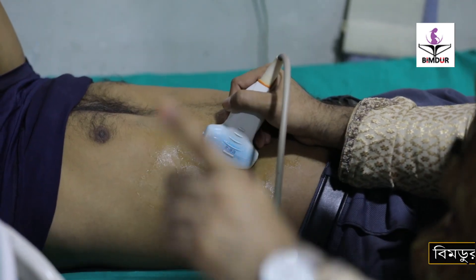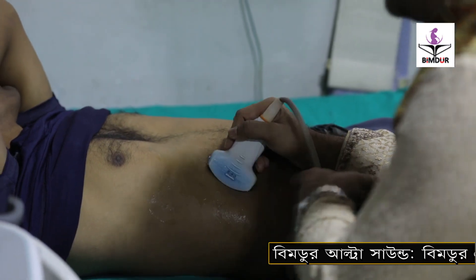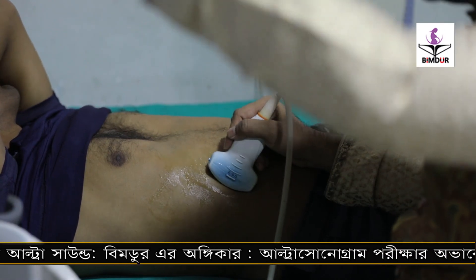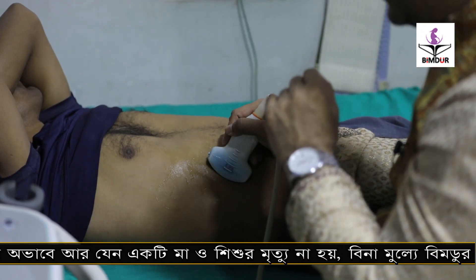The correct approach: when your probe direction is sagittal, you measure length and anterior-posterior in that sagittal plane. These are the measurements you can take — length and anterior-posterior.